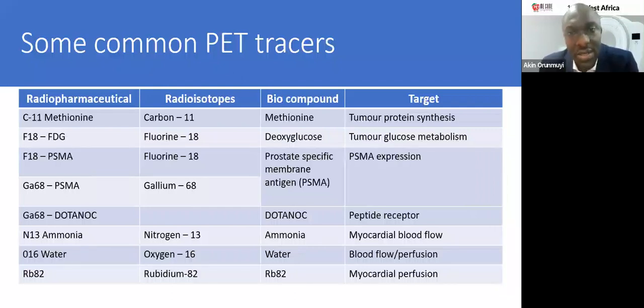Just recently, a breast imaging PET tracer, FES, was approved by the FDA. And we expect that to also improve the diagnosis and staging of breast cancer with PET. Next slide, please.